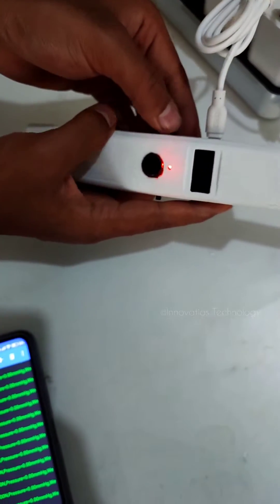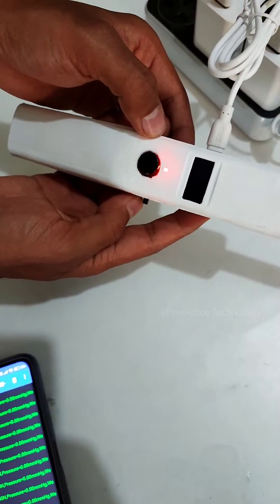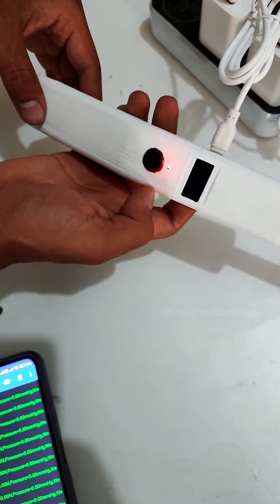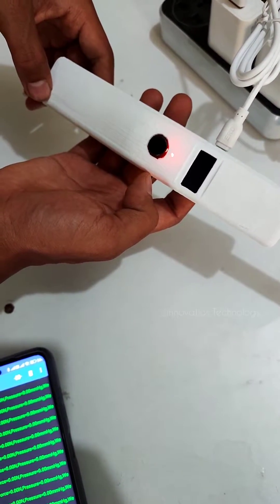Slide the cable in gently. The red color LED indicates charging status — it shows whenever the device is plugged in and charging.